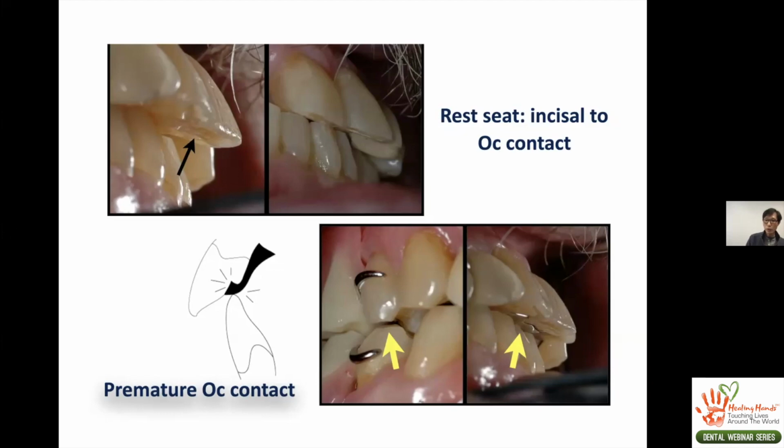So the partial denture was delivered with a deflective occlusal contact that goes against the cingulum rest in the anterior, and the denture teeth were functioning against each other. But then you can see the premolars, which would be the abutments for upper and lower partials, and they are not occluding each other because the OVD has been altered by means of the partial denture. So this is not really sound dentistry.